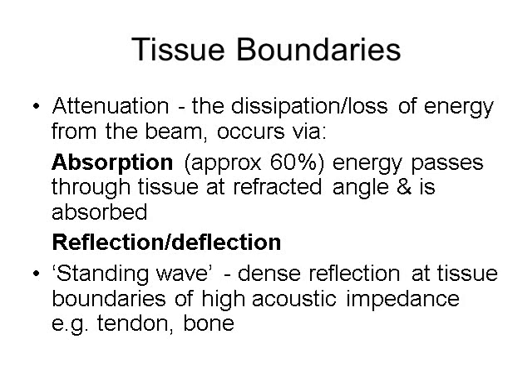An important concept is that of a standing wave, where at tissue boundaries, the reflected wave may combine with the incoming wave. This is particularly a risk at tissue boundaries with bone.